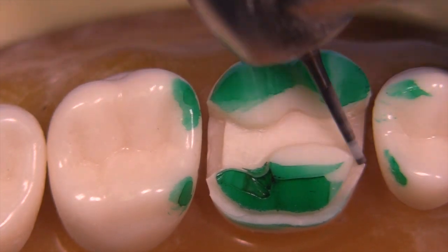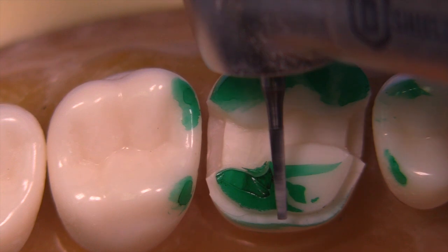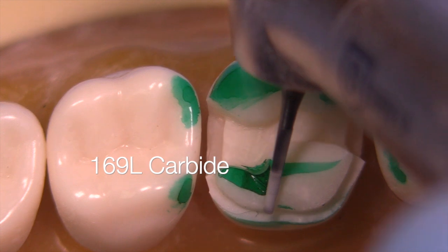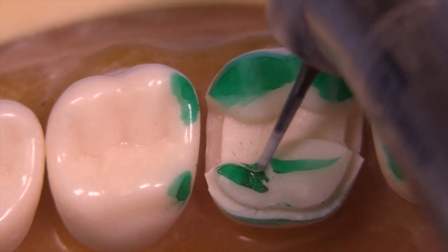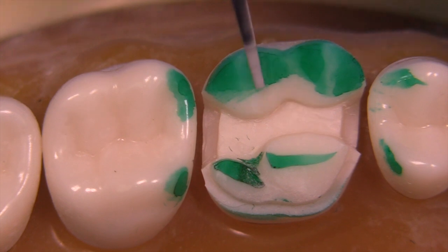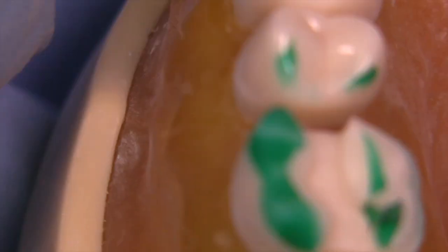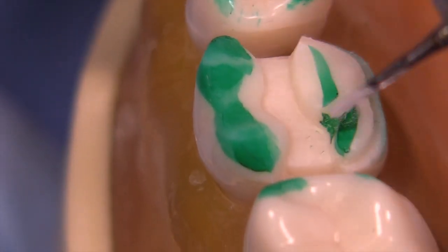At this point I'm going to reduce a little more of the A-plane and B-plane with the 169L because we were a little conservative in our initial reduction. The clearance we want should be 1.5 millimeters on the lingual functional cusps and 1.0 millimeter on the facial cusps — it's less on the facial for aesthetics, to preserve more natural tooth structure so we don't show an unsightly display of gold when the patient smiles.